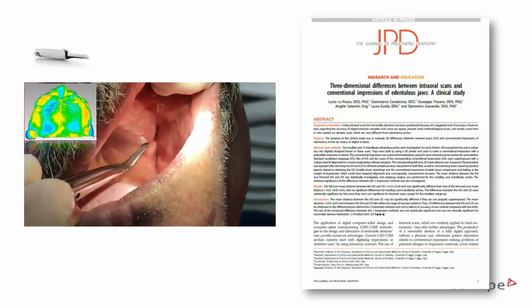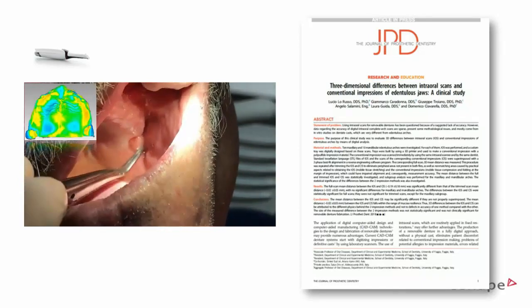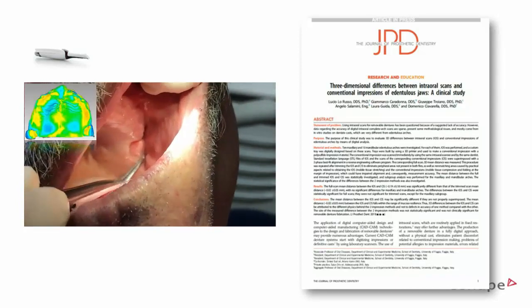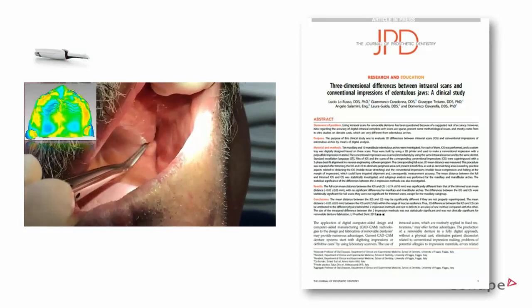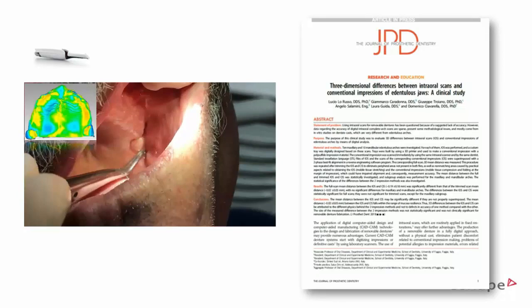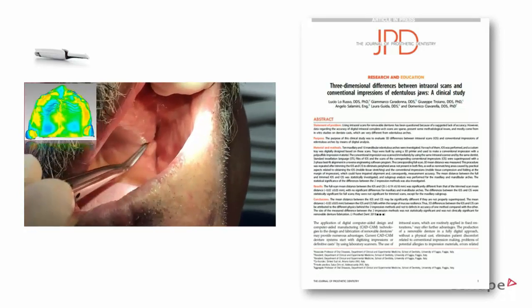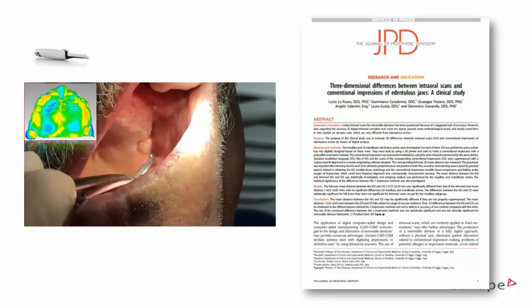More questions asking about the scan strategies and the bite, especially with edentulous patients. There's another question here: did he make a function impression in the try-in? I don't think anyone does function impressions for try-ins. Of course, you do it when you need to, but I don't think that's the standard. I know a lot of people are using intraoral scanners for try-ins.